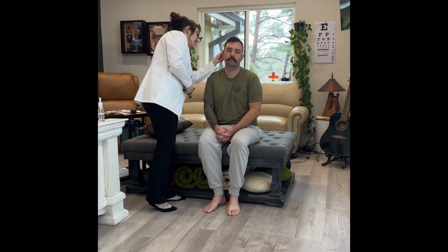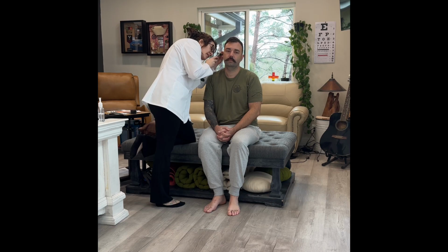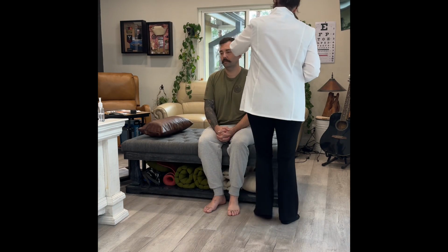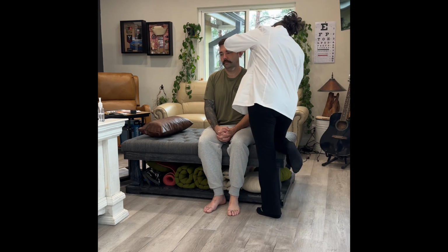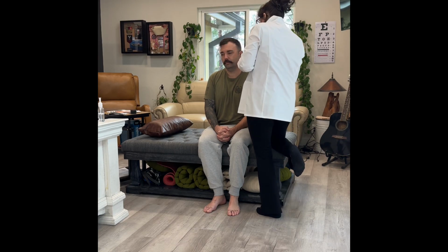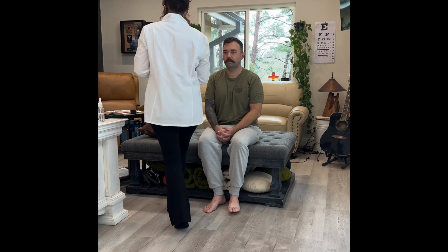Now I'm going to check out your ears. I'm going to look at your auricles on both sides, and your ear canal on the right side appears normal. I'm going to have a look inside your ear. And I can visualize the eardrum, which appears to be within normal limits. On the other side, same thing. Auricles appear normal, and the drum is visualized, and everything appears within normal limits there.